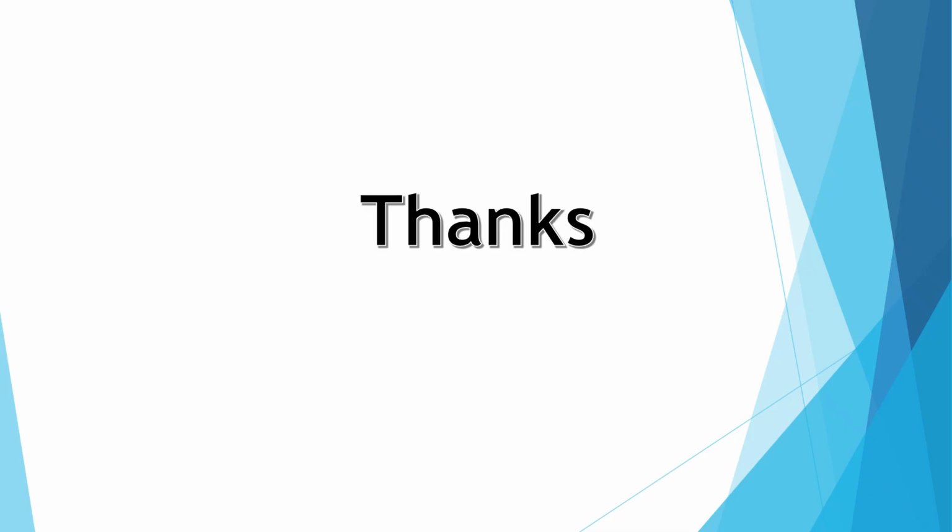By this, we have concluded the lecture. I'm sorry it was a long lecture, but it is important. There are lots of details and basics that you need to know in order to put the program together. Most of the things that are in the 2 lectures are actually the basics, and you will use them whatever frame you're using. There are very few things that are specific for the MAXFRAME, but I hope this lecture will help you whatever program and whatever device you're using, because most of the things are applicable to other frames and other software.